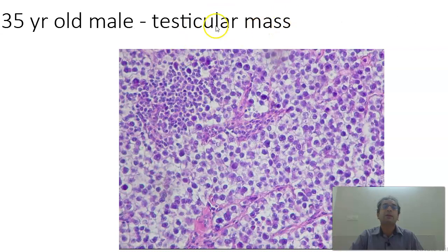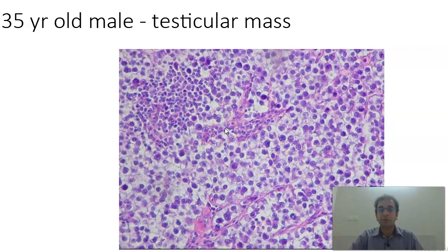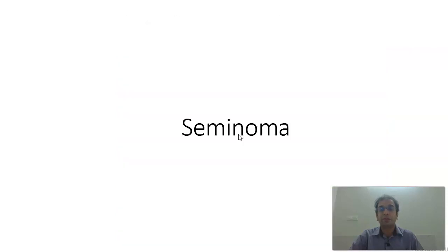A 35-year-old male patient with testicular mass. What you find is nests of glycogen-rich cells with a clear cytoplasm, having fibrovascular septae rich in lymphocytes and plasma cells. This is likely to be a testicular tumor — specifically a seminoma.